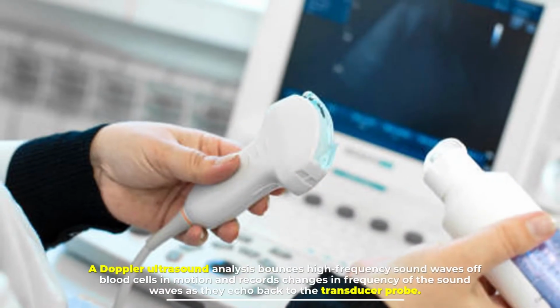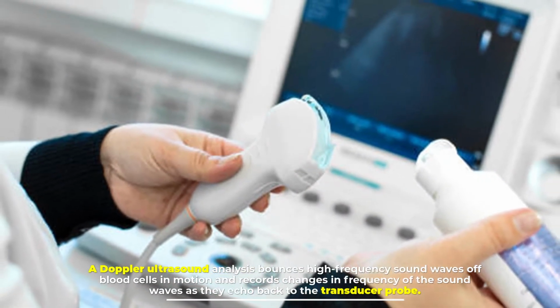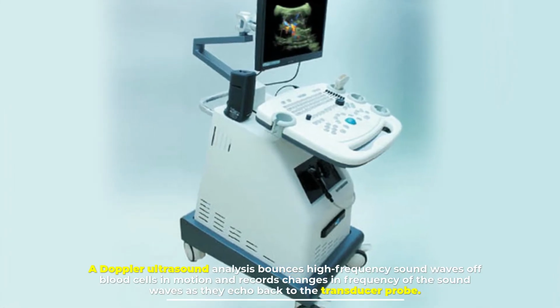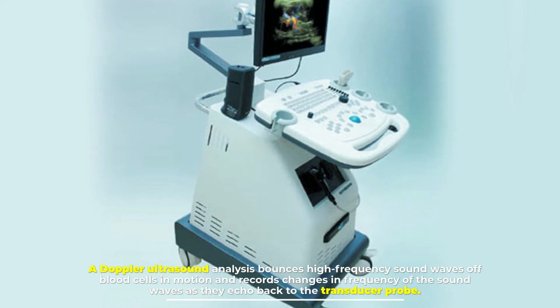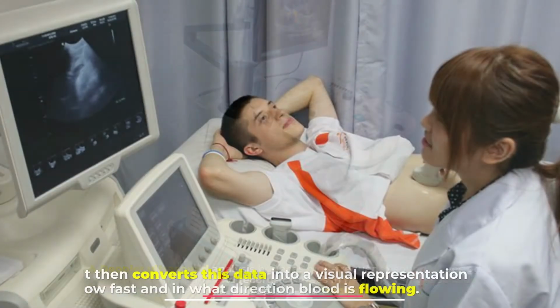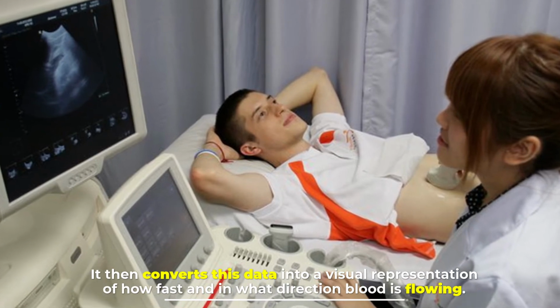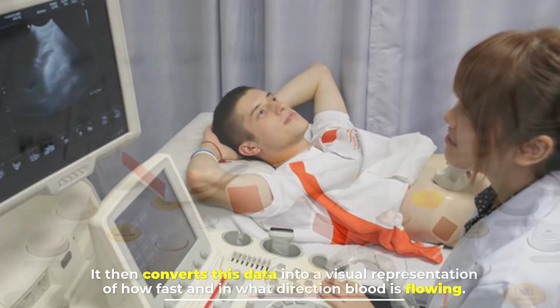A Doppler ultrasound analysis bounces high-frequency sound waves off blood cells in motion and records changes in frequency of the sound waves as they echo back to the transducer probe. It then converts this data into a visual representation of how fast and in what direction blood is flowing.